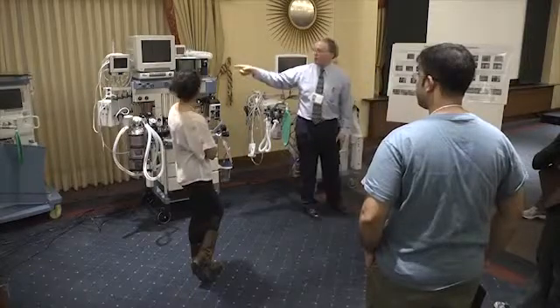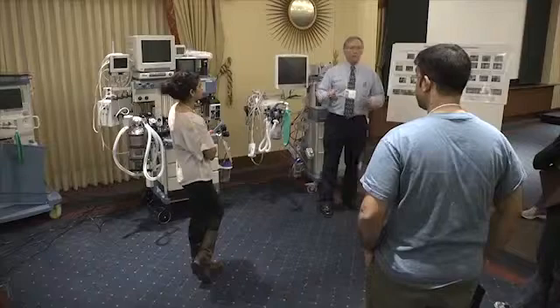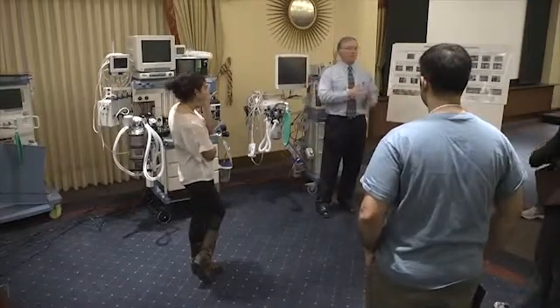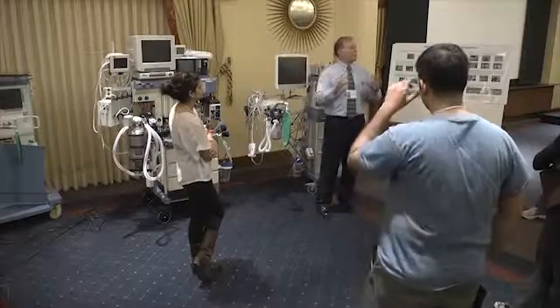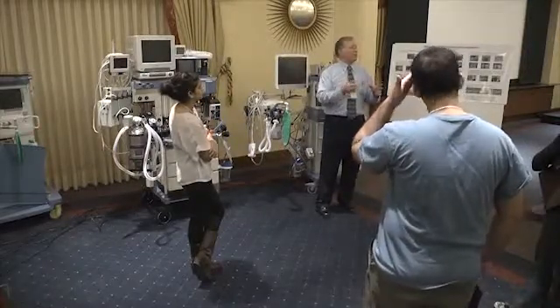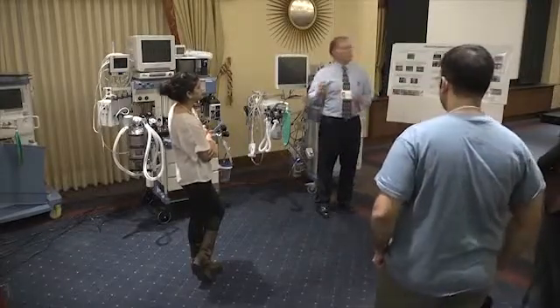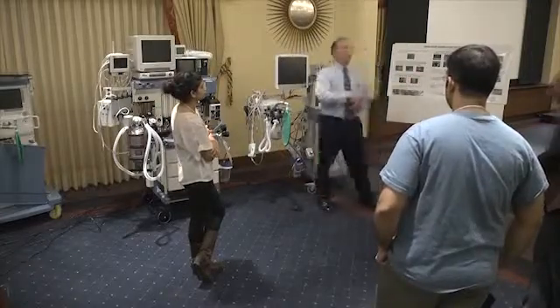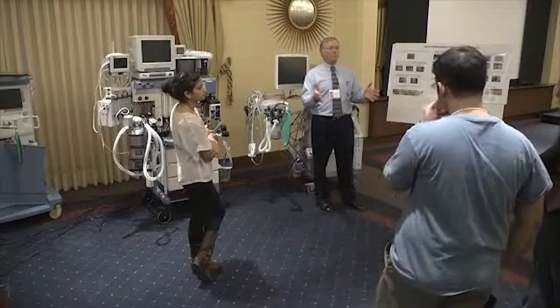Now the Apollo, when you do that one, you basically set it up for any of you who know the Apollo, and you hit the go button, and boom, it starts doing its test, and it takes around 3 minutes from beginning to end, unless there's a problem. Then it just shuts itself off and says stop. You haven't done this, you haven't plugged this, you didn't turn this on or whatever. Well, the problem is with most operators, as soon as they hit the go button, they run out of the room. Then they come back, and they think the machine's done, and all of a sudden they find out it just died in mid-stride.